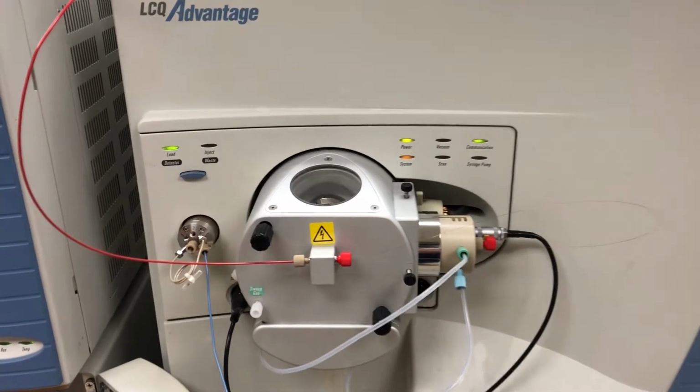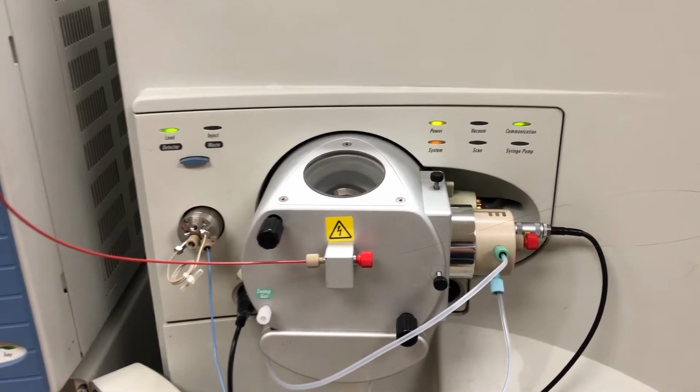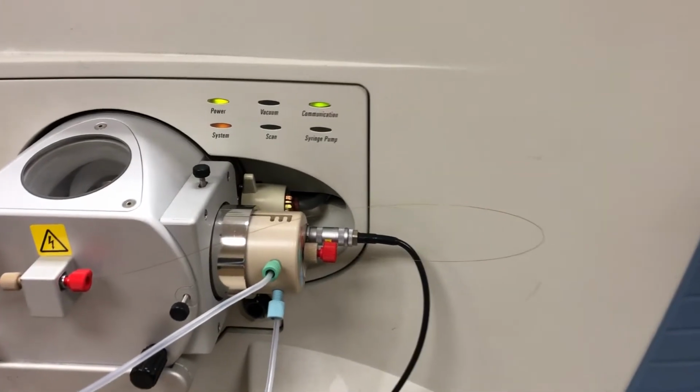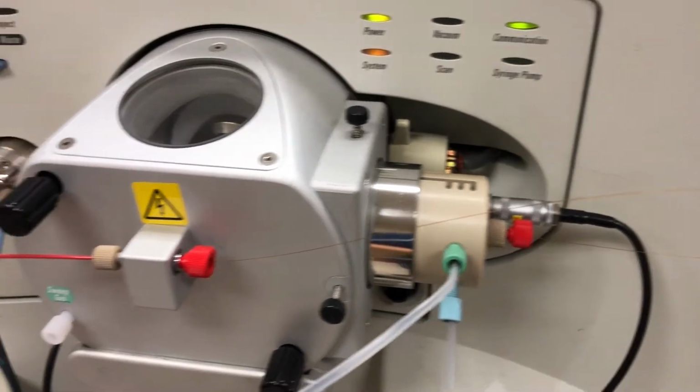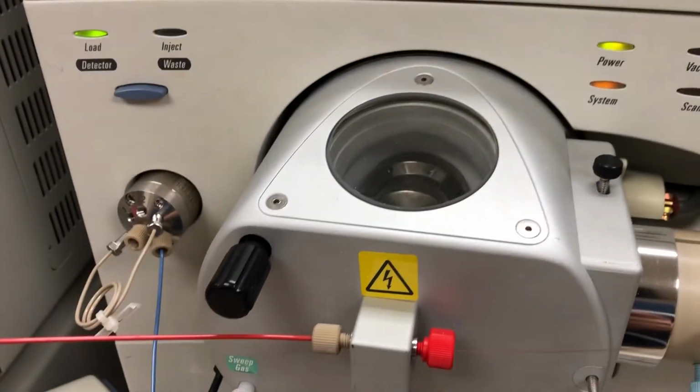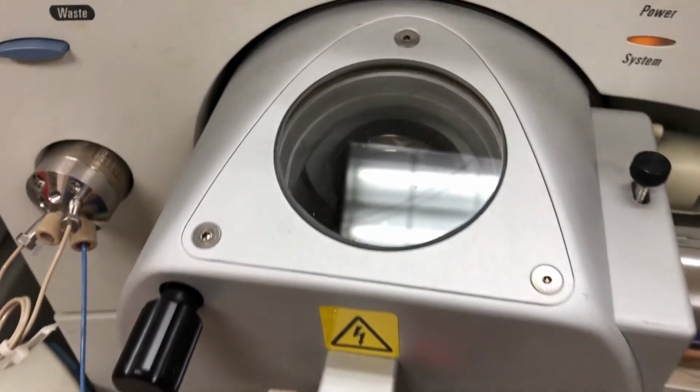So here is the LCMS that you will be using a lot for forensic toxicology. You can see there's a capillary tubing. That should look familiar from GC. That brings little bits of liquid into the source. And then there's the voltage and the gas that can come in.